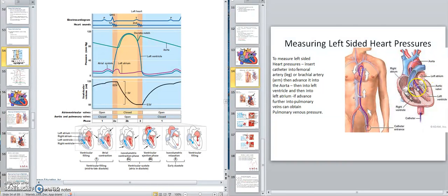The catheter is placed in the left ventricle, getting some pressure recordings. We said right here, the left ventricle is doing an isovolumetric contraction, a rapid rise in pressure, like squeezing on a closed water bottle. We said here that you now have opened the outlet valve. See, to start it, you close the inlet valve. If this is the left side, then you close the mitral valve, bicuspid valve. Then the pressure started rising because you had a closed valve and you're squeezing down.